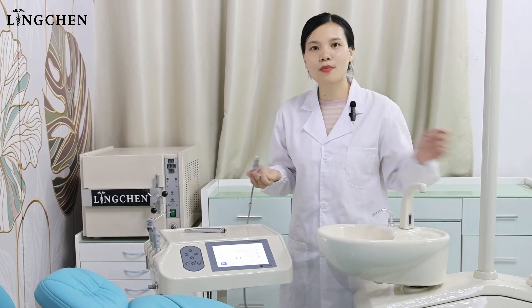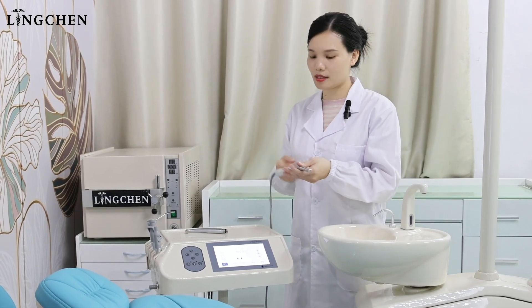The implant motor features low noise, low temperature rise, stable speed, and high torque accuracy. For the motor and the cables, they can be sterilized under high temperature and high pressure up to 1,000 times.